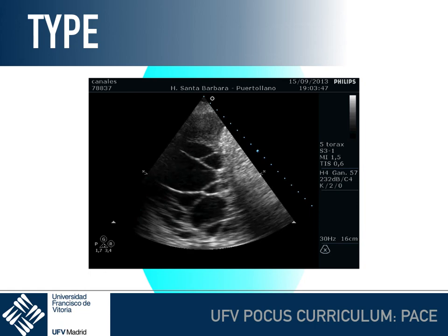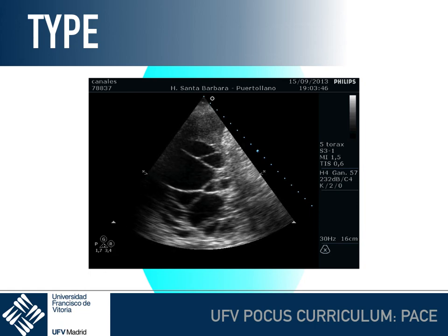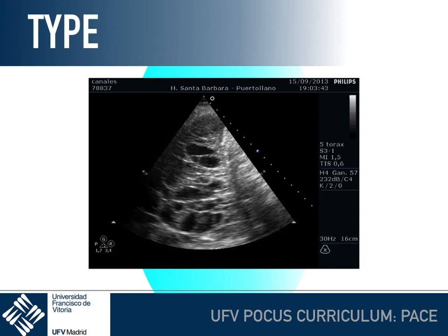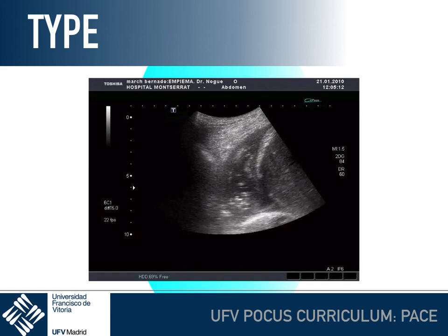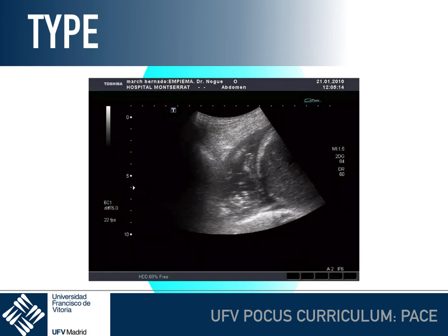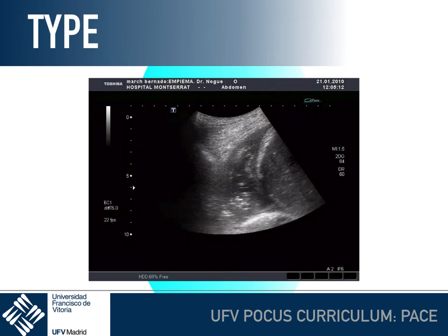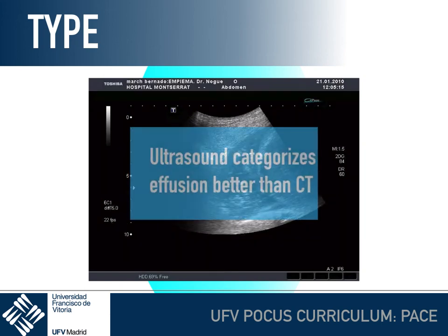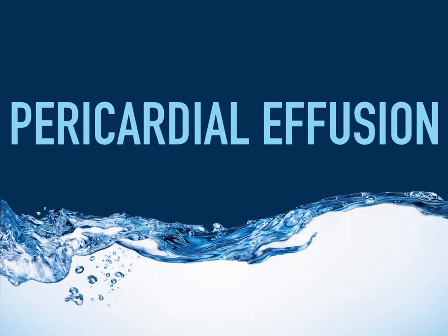We can assess much better complex effusions, like this septated effusion, or this thick fluid full of gas bubbles, which is an empyema. So for sure, ultrasound is better in terms of sensitivity than a CT scan to categorize the effusion.